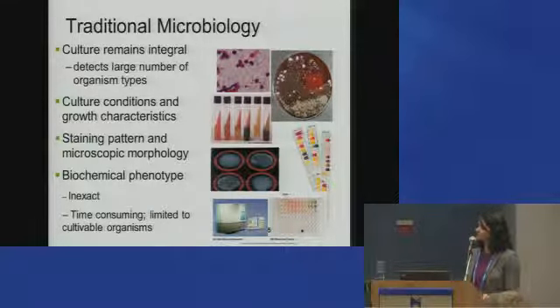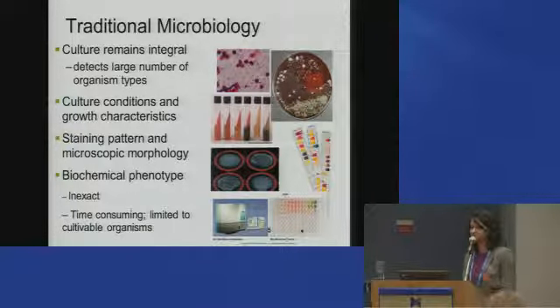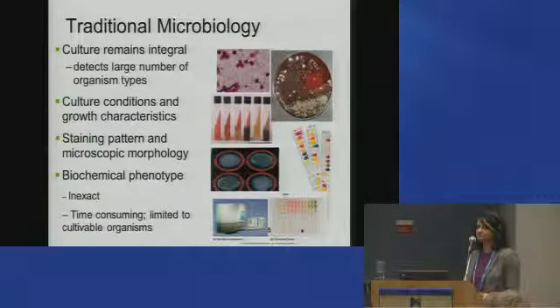So we really do have to end up trying to culture a lot of these different sample types, because not all these sample types are sterile, okay? From sterile sources, yes, you can certainly make certain more predictions. But with non-sterile sources like your BALs, your respiratory, your sputums and all of that, you really have to find out the relevant pathogen. So culture still remains very integral for clinical microbiology.